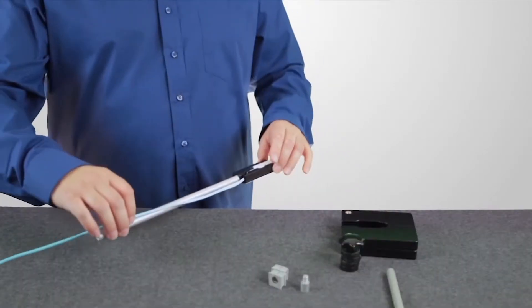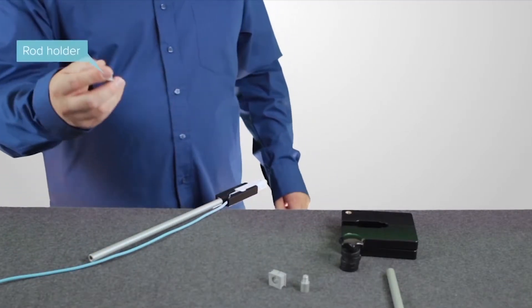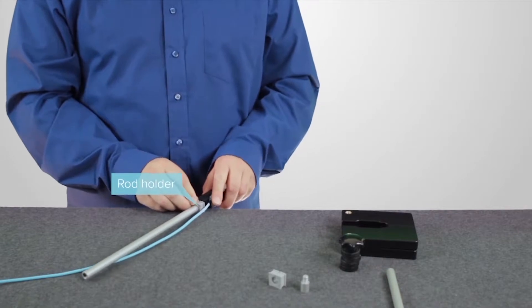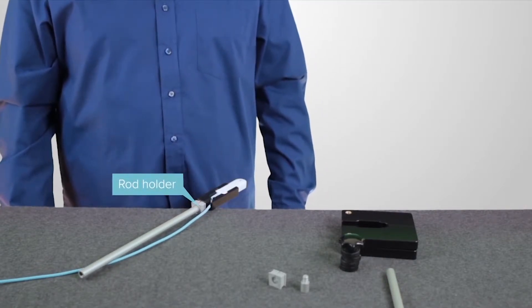You can place it over the edge of an examination table. You can also use this little rubber piece to make the rod stay firm and secure on the table.